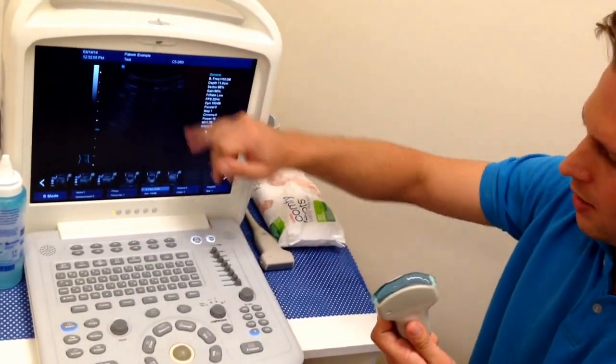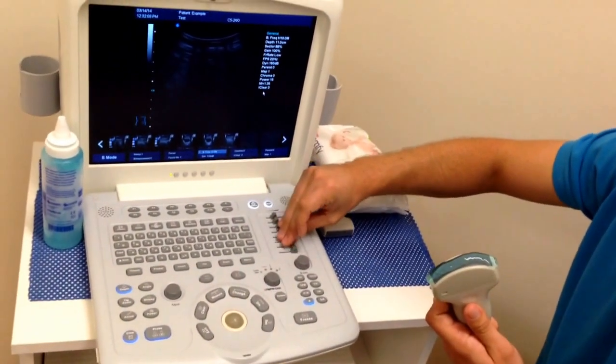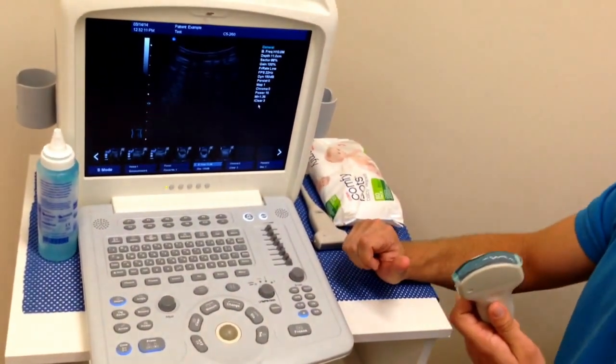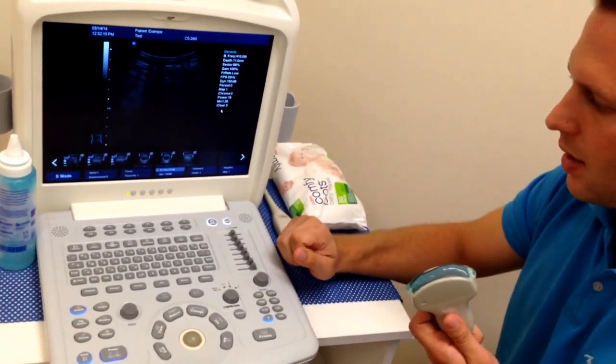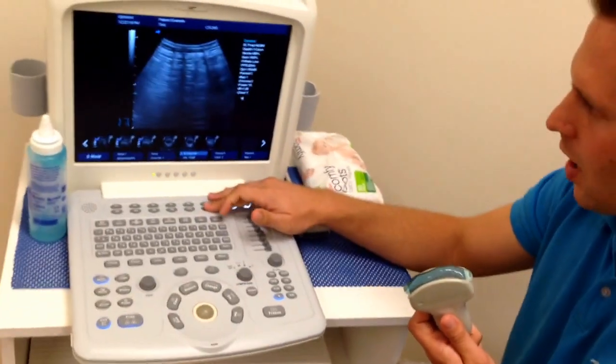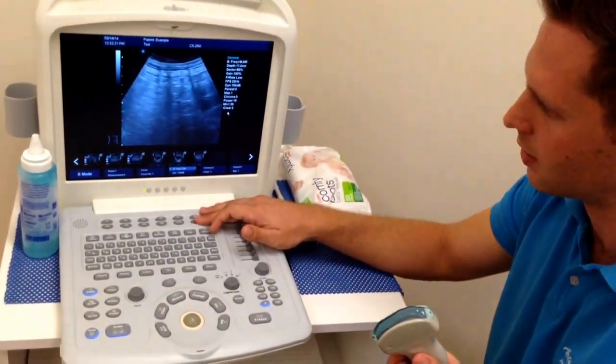It's not normal for a curved or convex probe to be able to get 10 megahertz, so that's why we get a very dark image and can't really see much with it. As a general rule, you want to go to the highest frequency that you can still get a decent image with — so we're going to come right back down to maybe 6.5 if we want to see a reasonable picture on this.